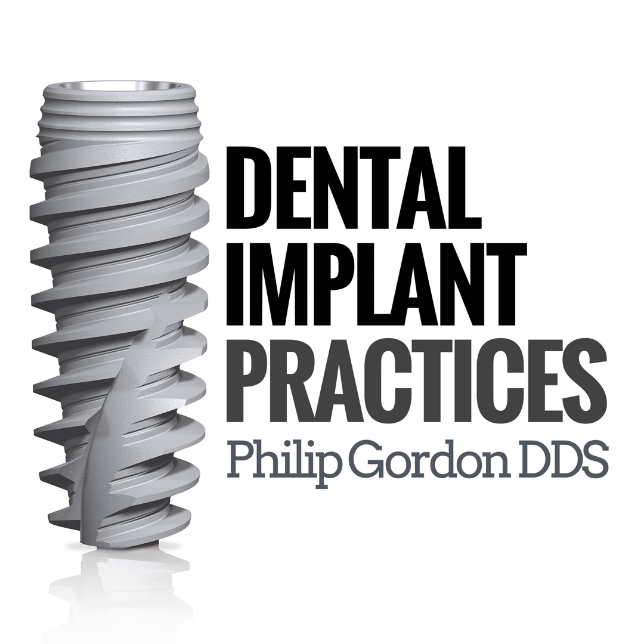Somebody made him a huge partial in the back. He was unilateral, missing the posterior molars and a bicuspid. His tongue was constantly rubbing on it. His claim to fame is he could speak. He was great at announcing, doing commercials, selling products. He was probably one of the best announcers, but it was rubbing his tongue, and he said it was destroying my career. So I said, "Here's what we're going to do for you."